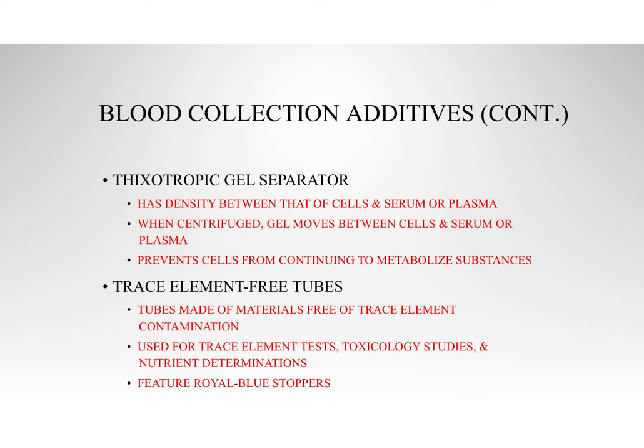So just know thixotropic gel is that separator portion, and especially after you see it in the lab and then you see how it works, it makes perfect sense, okay? And then we have trace element free tubes.